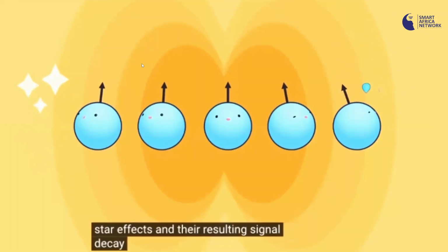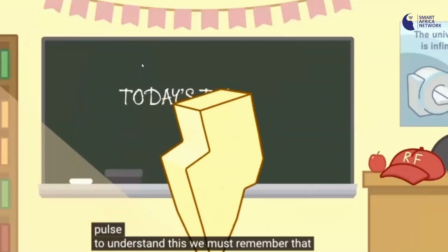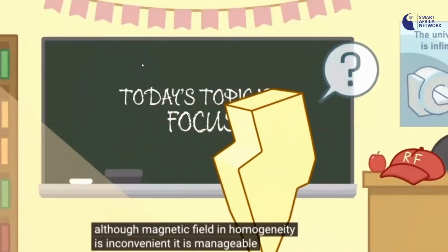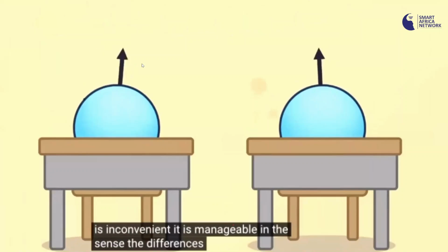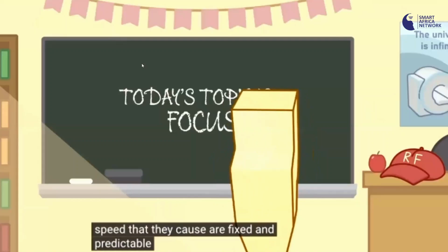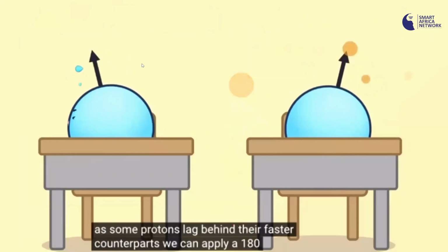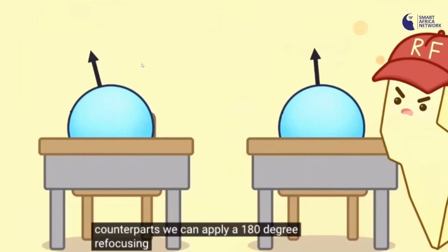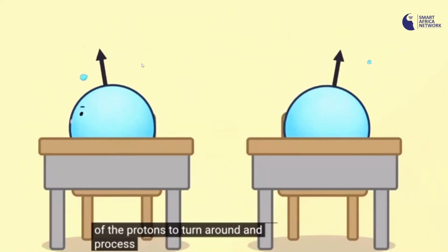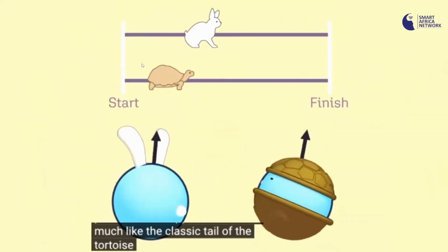The good news is that we can combat T2 star effects and their resulting signal decay with the addition of another RF pulse. To understand this, we must remember that although magnetic field inhomogeneity is inconvenient, it is manageable in the sense that the differences in precession speed that they cause are fixed and predictable. As some protons lag behind their faster counterparts, we can apply a 180-degree refocusing RF pulse that instructs all of the protons to turn around and precess in the opposite direction.